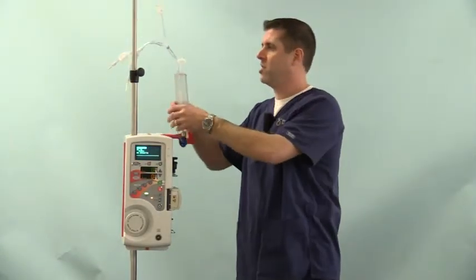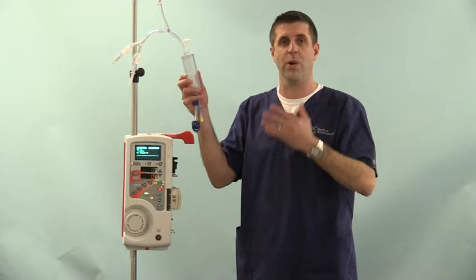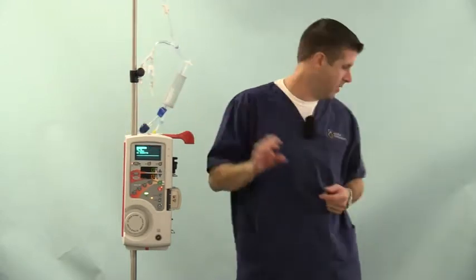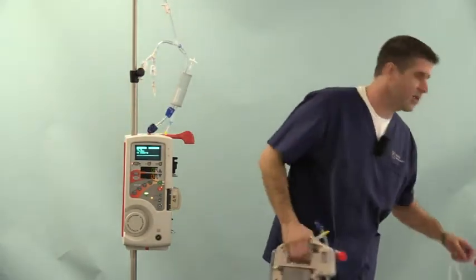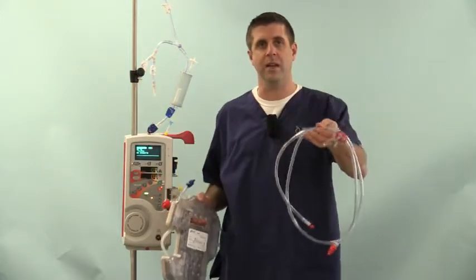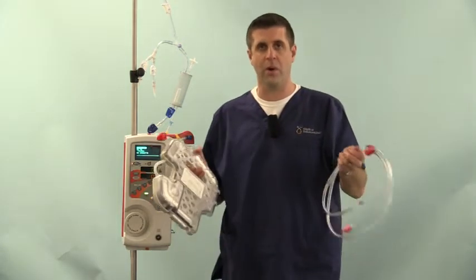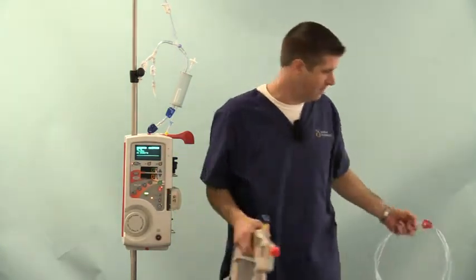In your sterile packaging, you'll get 3 essential items. A triple spike, if you're going to run a triple spike. If you're going to use a large reservoir, that'll come packaged separately. You'll also get a sterile packaged cassette and a patient line, either a single 6-foot patient line like this or a dual patient line. We're going to prime with the single patient line.